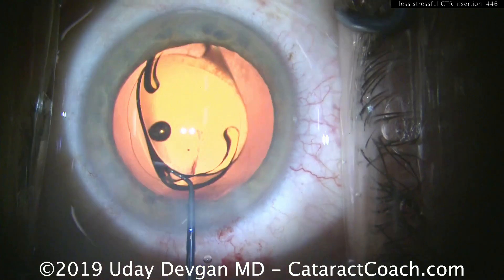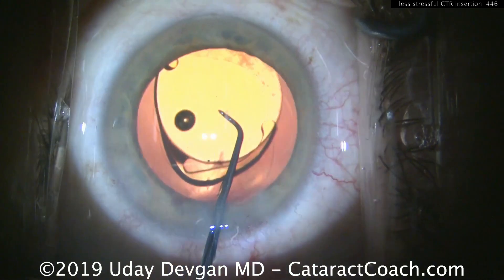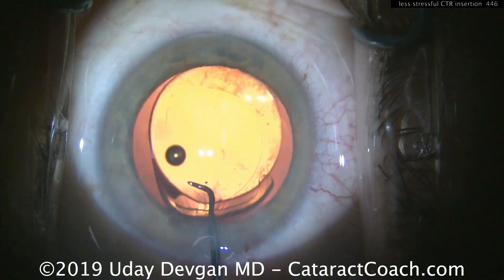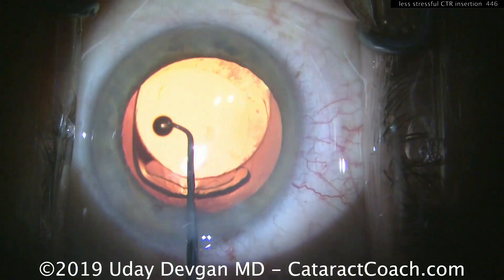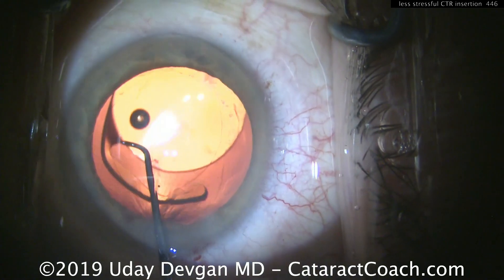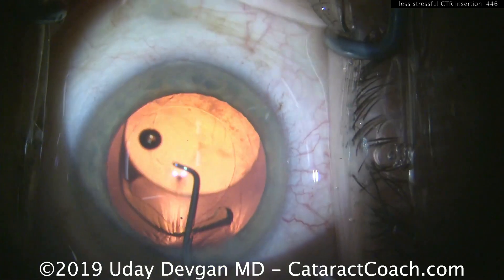I want to encourage you to give your submissions to us. You can submit any video you want on the CataractCoach.com website and we can incorporate it for our learning and the benefit of our members. So try this technique with the CTR — let me show it to you one more time.